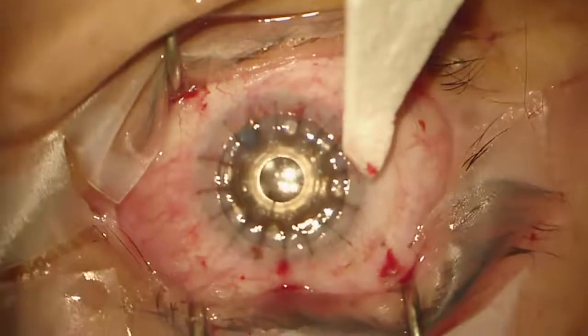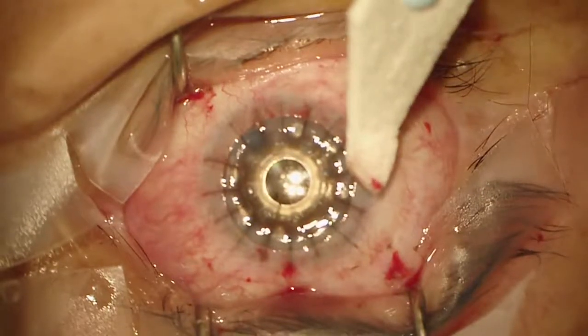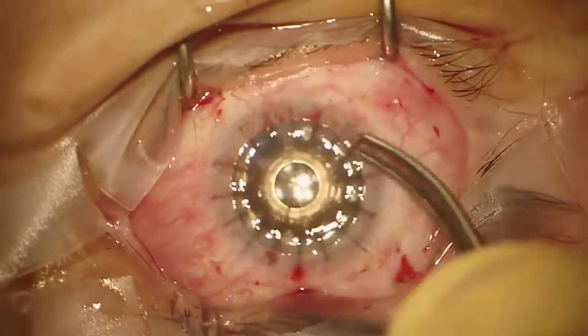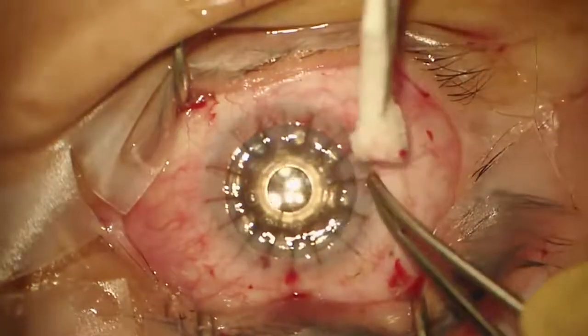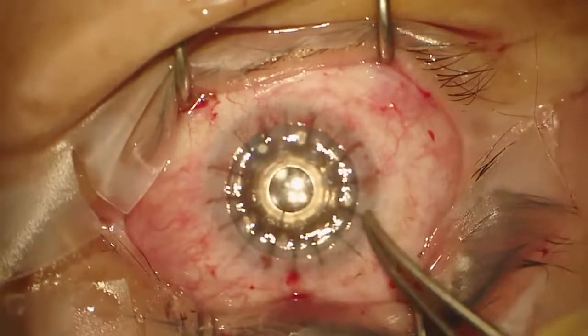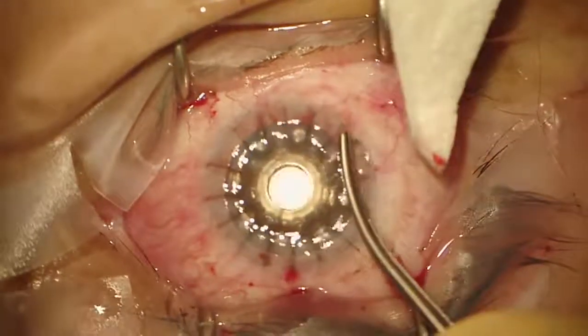Actually, this one looks like it's sticking up a little bit, so we'll remove that. Is it leaking a little bit? Not too worried about that, actually. I think once the tissue deswells, that will stop. See, this is all a big rigid piece, so there is always a little bit of leakage, but when the swelling stops, that will go away.